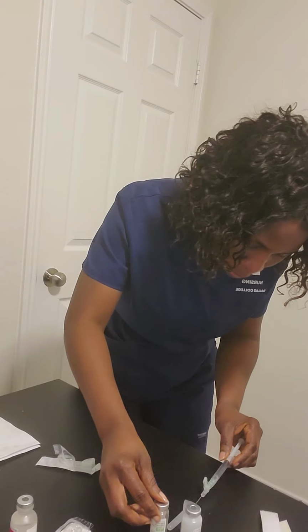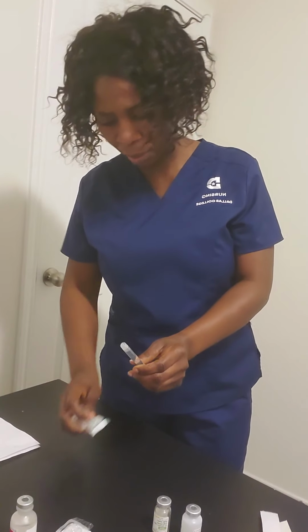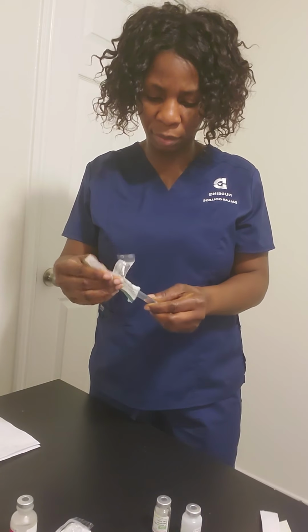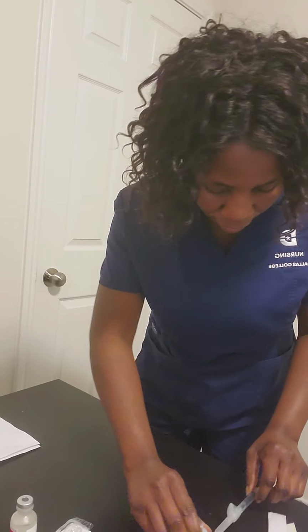I'm going to scoop. I'll take off this needle, put it in the sharps container, and I'll be fixing a clean needle. So I've been able to draw and put on a clean needle. So I have this here, just to set it aside.